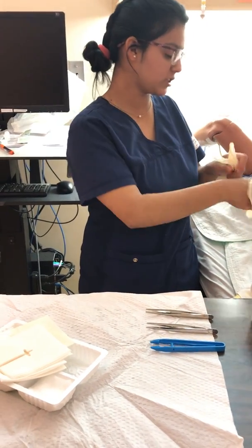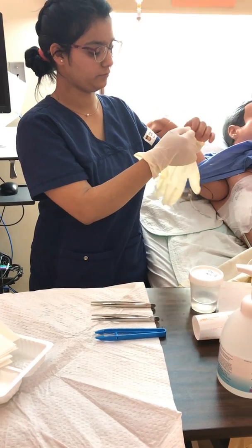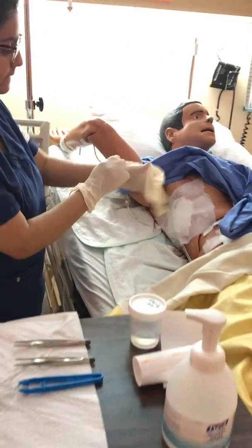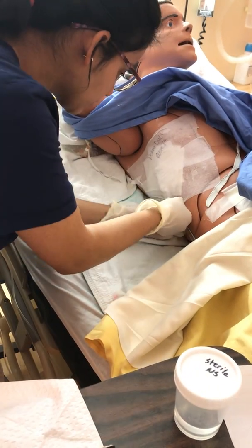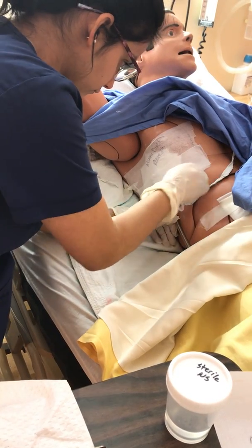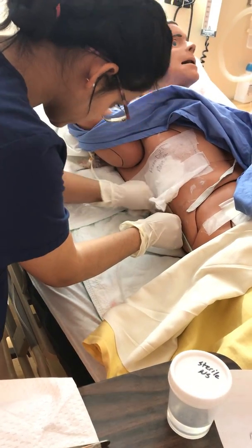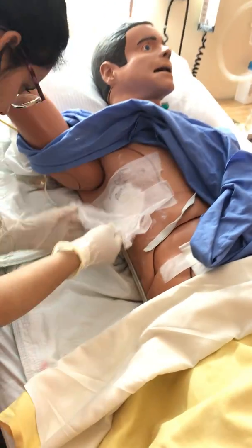And we're going to take this old dressing out and dry that out. I'm going to clean down the tube. I'm going to check the suction again. And now that I have my gloves on, just make sure that we stabilize the tubing. I'm going to have one swipe round, one swipe dry, because you always want to stabilize. To 120. So now it's about 95, so that's perfect.